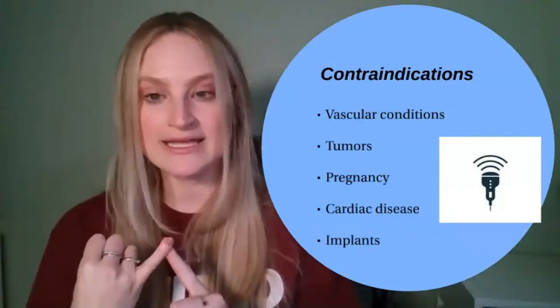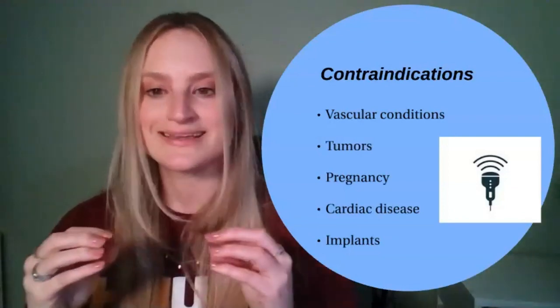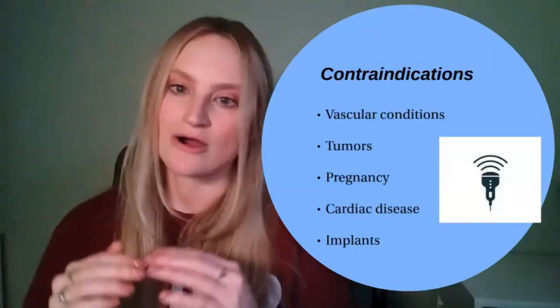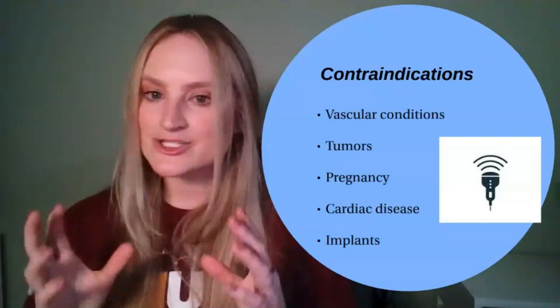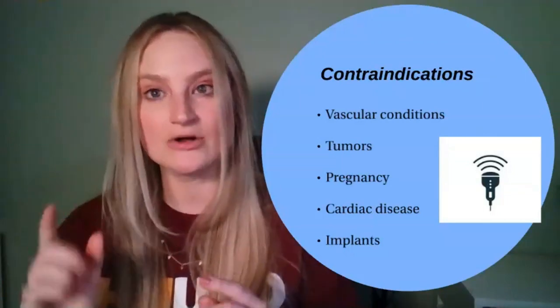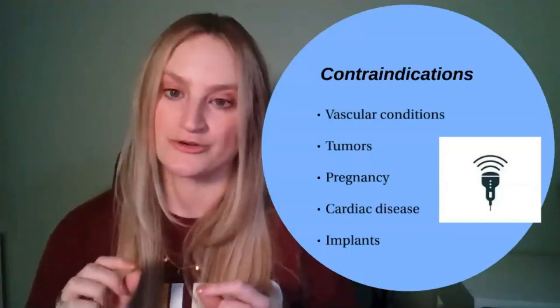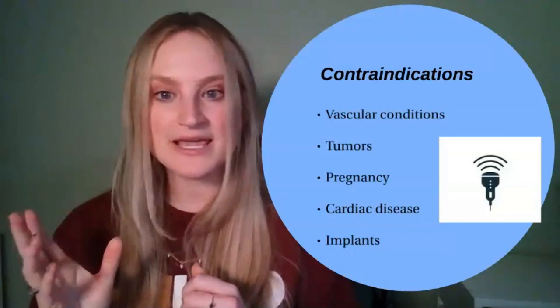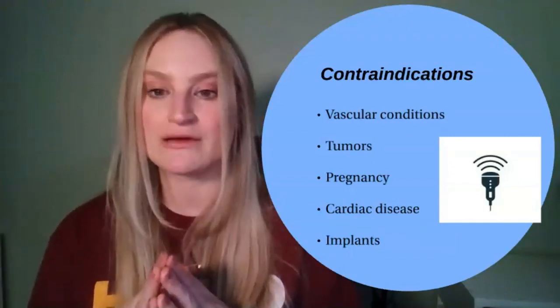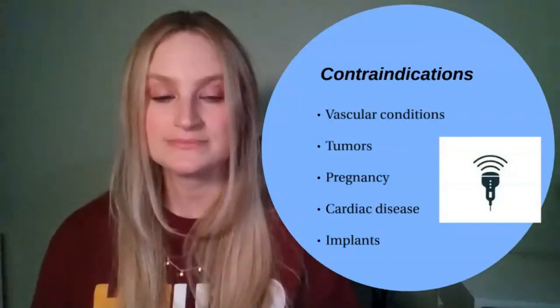Avoiding abnormal vascularity in ischemic tissues is imperative, as the heat dispersion is not even and heat has nowhere to go, so it could do more harm than good. Cancerous tumors are another contraindication, as some research indicates that ultrasonic therapy on tumorous areas may encourage the tumor growth. In some cases, even pregnancy can keep a patient from engaging in therapeutic ultrasound, especially therapies anywhere near the uterus.